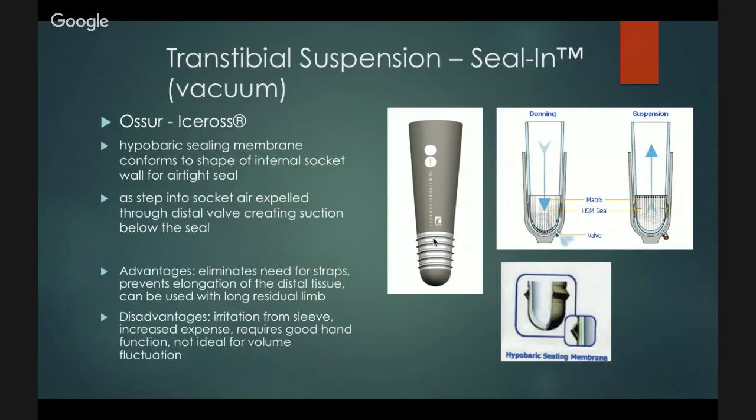As a stopgap measure, what some prosthetists tell the patients to do is put a half sock directly onto the skin and then fit their leg into the liner, but still that's not ideal. So somebody needs to be really stable.